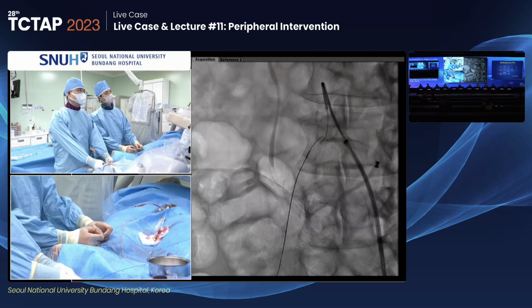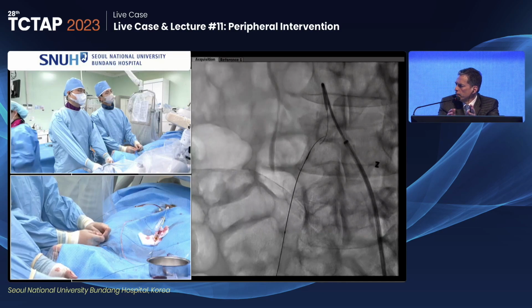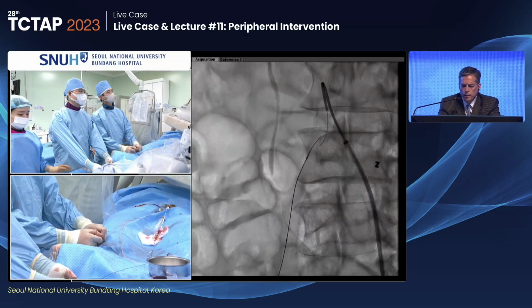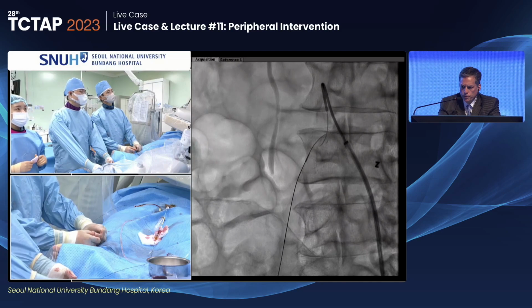Because I think most of us know, the amount of tissue when you go subintimal in the aortoiliac is really pretty generous. And so it depends on how deep you are to be able to pop back into the lumen. That's where the re-entry catheters are so useful.